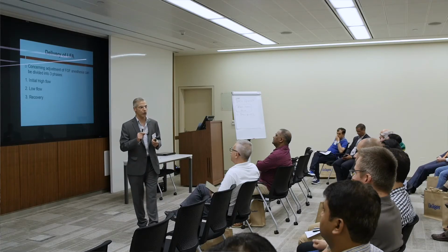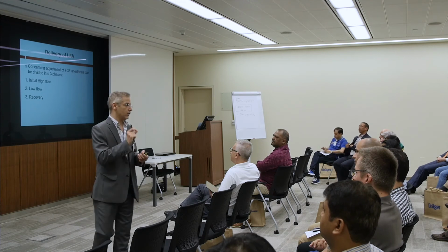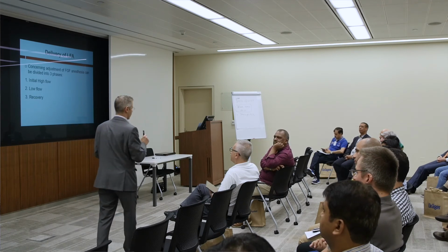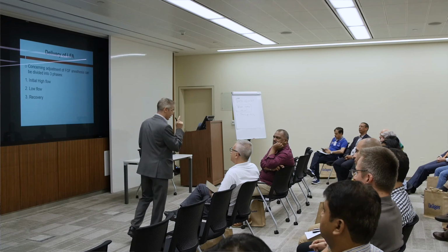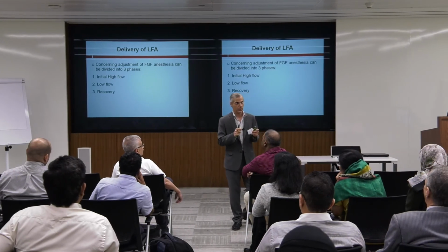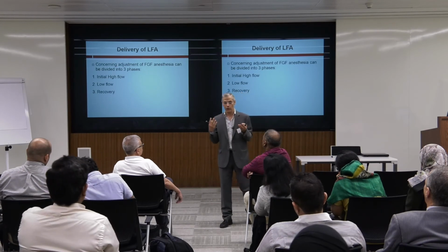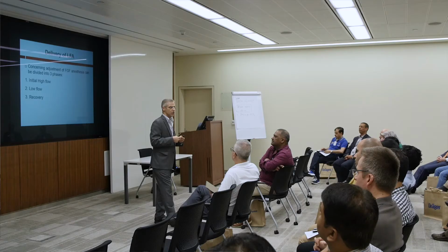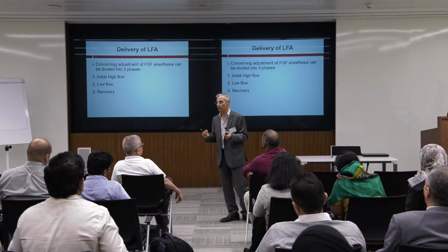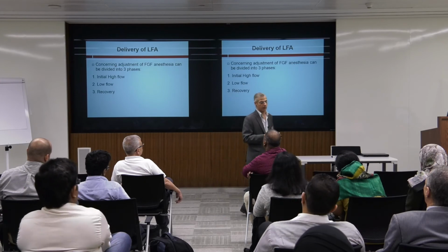It's impossible to reach the desired end tidal volatile anesthetic from the first minute manually. You can do it automatically by the automatic gas control or target controlled inhalation anesthesia, whatever the name of this technique you are using in the machine. But some of our colleagues, after insertion of the tube, are just opening the fresh gas flow at 0.5 and 0.6 from the first minute. And I think they will never reach the target, whatever they do.